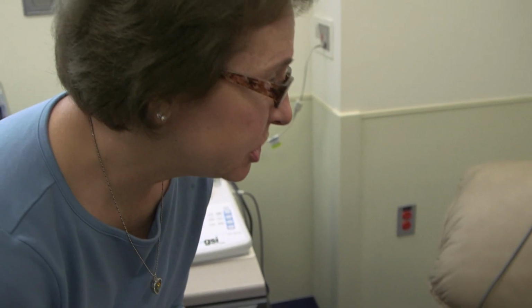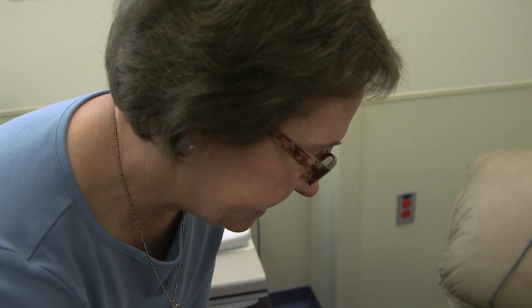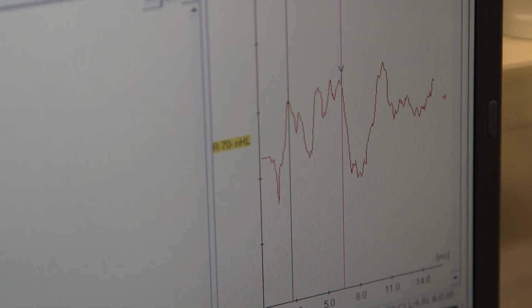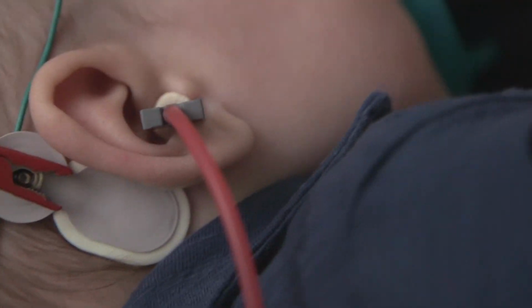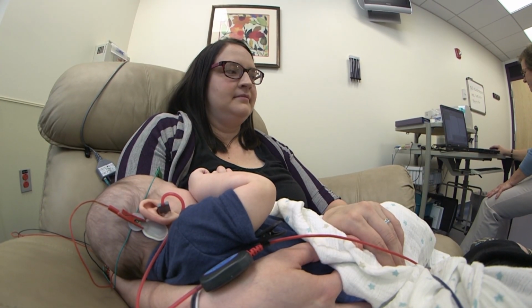This next test we're going to do is the auditory brainstem response test. For the ABR, we actually put little electrodes on the head, usually one on the forehead and one behind each ear. And then again, we play a sound to the ear and we can measure the response from these little electrodes.